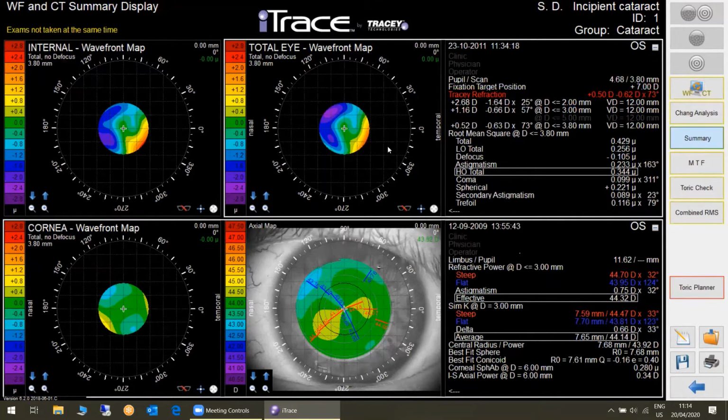He says, oh my God, my retina is gone. So he runs to the OCT, they take an OCT, everything perfect. He says, oh my God, I might have keratoconus. And now he runs to the Scheimpflug image, the Pentacam, and everything looks normal. And now he really has a problem. Because he says, I'm a good surgeon, and my colleagues are good surgeons, and nobody knows what's wrong with me. I've got a brain tumor.